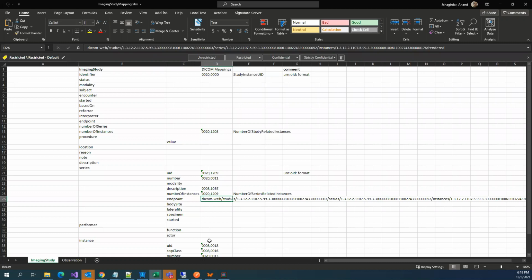We'll take some examples, and then we will try different things, like how you go through an array, how you pick only a specific JSON path, or how you write an if condition. Whatever is necessary for Connectathon, within the available time, we will try to cover. That would be an interesting session tomorrow. Please do join in at 11 o'clock. Don't worry about which templating language. It will still be fun to learn.